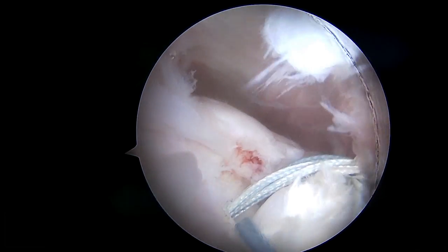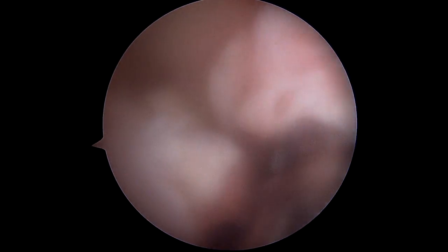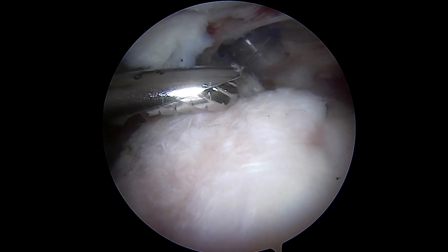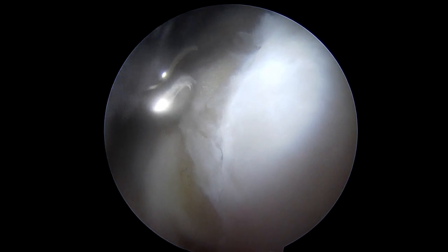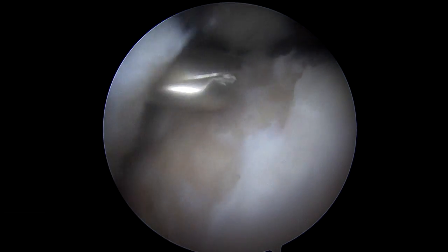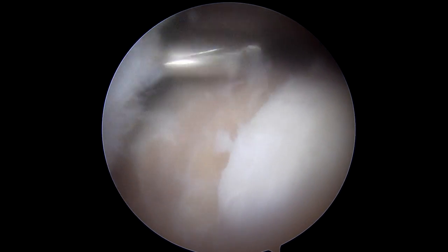There's our tenodesis. The screw is right beside it. Here's our subscap right there. Now I need to see where the edge of the articular margin should be, so I'm making a new footprint for the greater tuberosity. I'm running the burr on reverse so that it doesn't skip and get out of control, and we're back over to that bare area we were beginning to prepare earlier. I want to be sure and get all that soft tissue off.